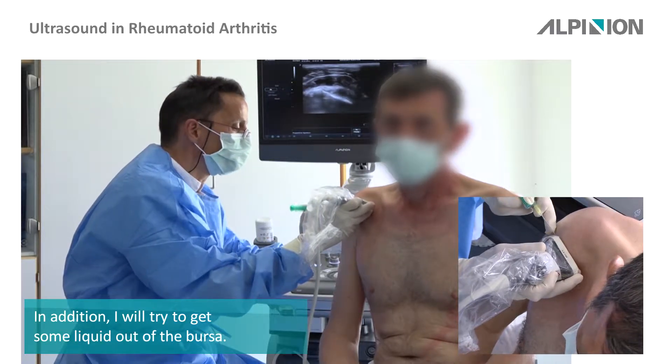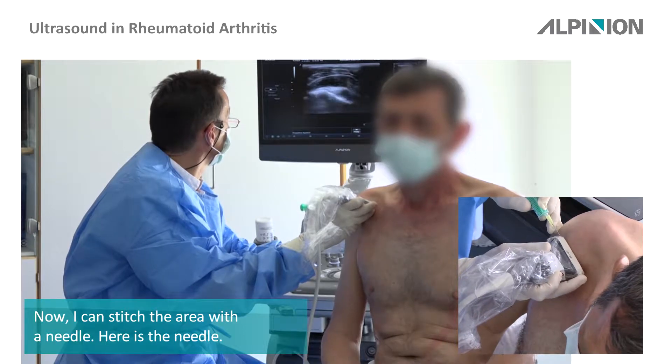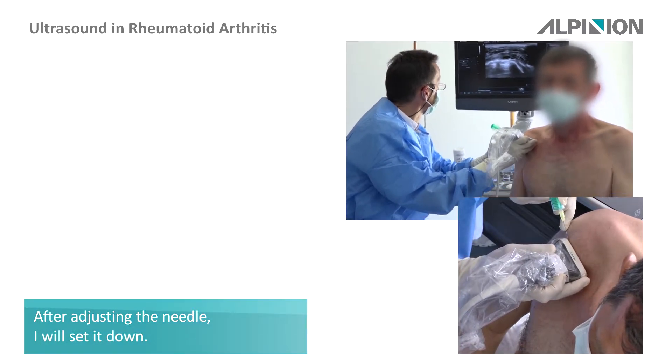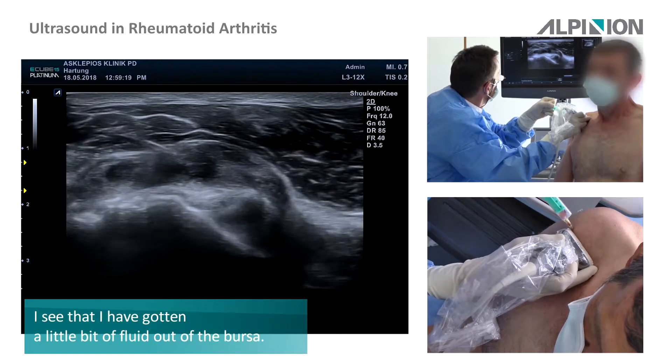Now it gives a stitch and I look — here's the needle. I have to adjust the needle a bit on the side down. You see that I get a little bit of the fluid around.